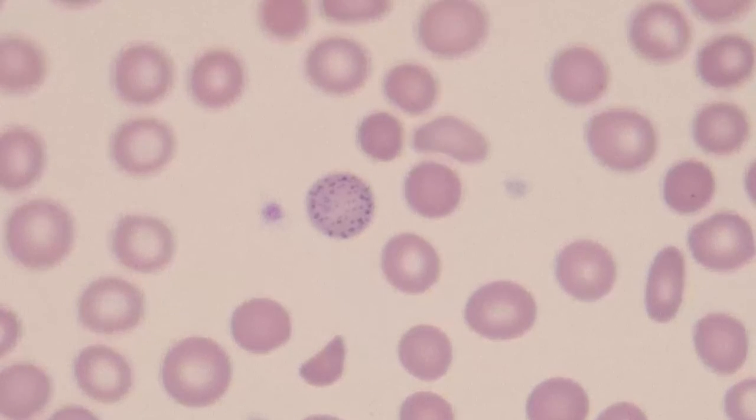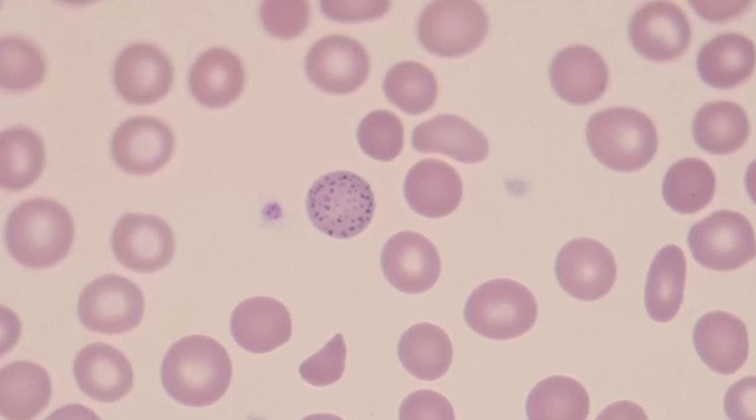When it comes to grading these, they can be graded either fine or coarse. I would say that this is more on the end of being coarse basophilic stippling. You can have fine basophilic stippling and really coarse. I would say this is somewhere in the middle.